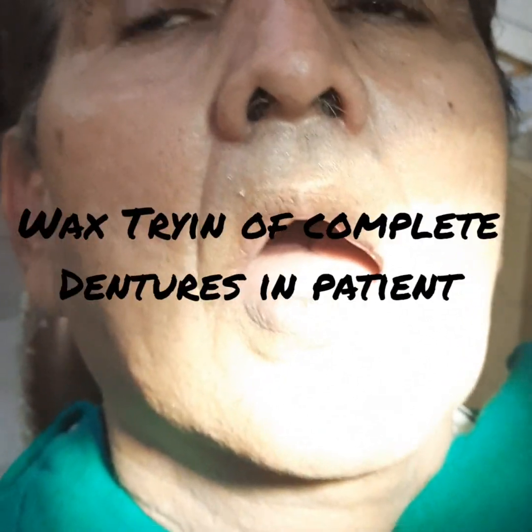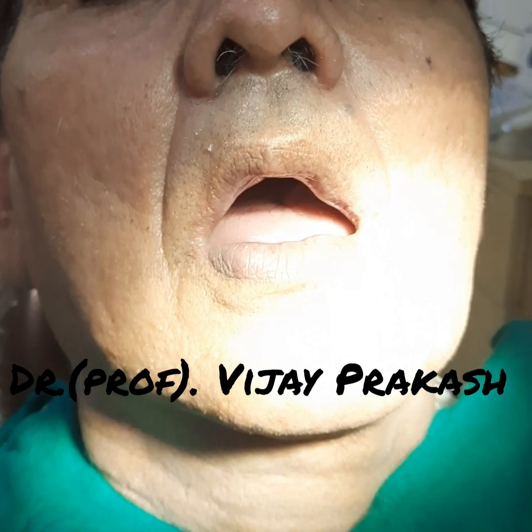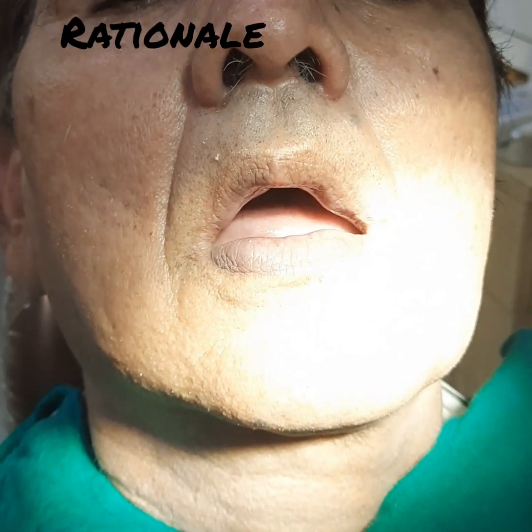Hello friends, I am Dr. Vijay Prakash and today I will be telling you about wax try-in of the upper and lower complete dentures. Something we have to keep in mind when doing the wax try-in is that we have to verify the centric relation, the vertical jaw relation, and the placement of the teeth in the arch.